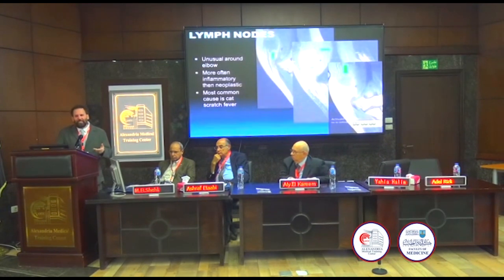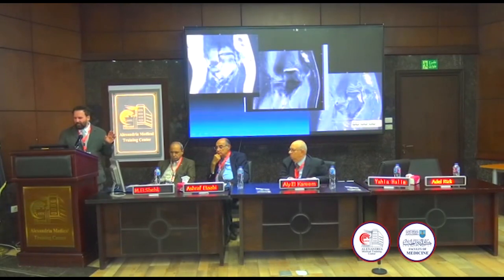I'm from Detroit. A famous musician from Detroit had a song called Cat Scratch Fever. It was Ted Nugent, and this is typically cat scratch fever. One of the few things on imaging where you can give the exact diagnosis. So this is T1, T2 and post contrast, and I think I have another example here. I see it maybe once a year.